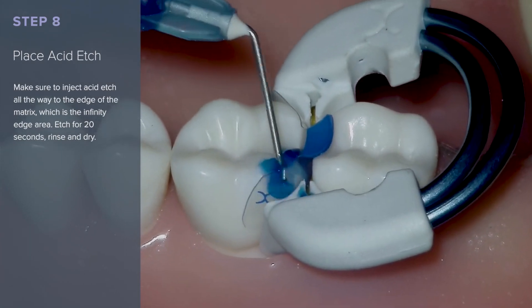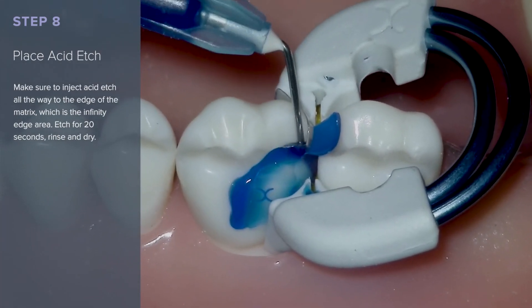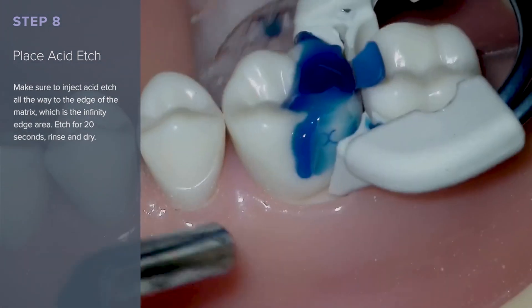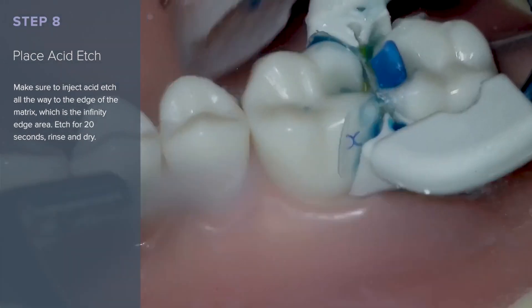Place the phosphoric acid etchant. Make sure to inject acid etch all the way to the edge of the matrix, which is the infinity edge area. Then etch for 20 seconds, rinse and dry.